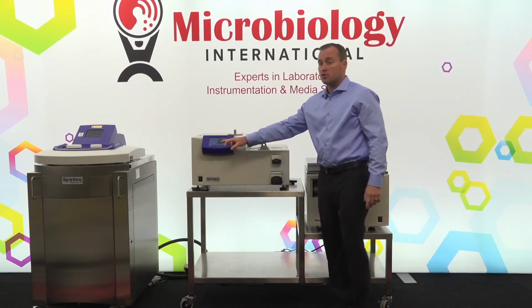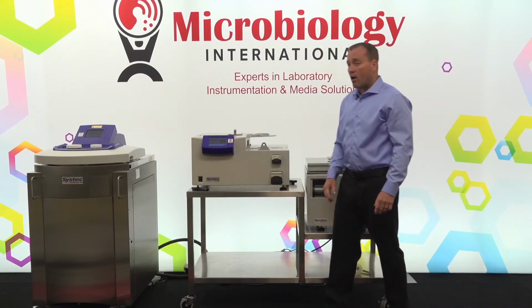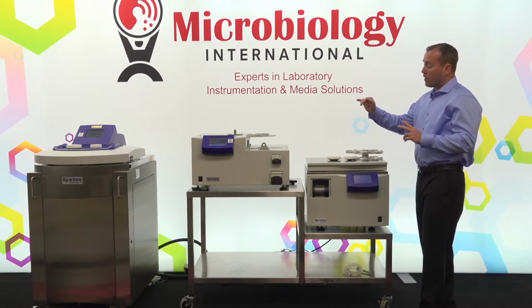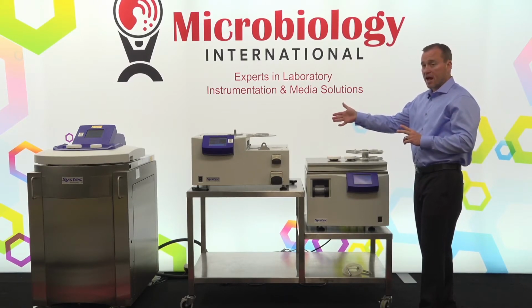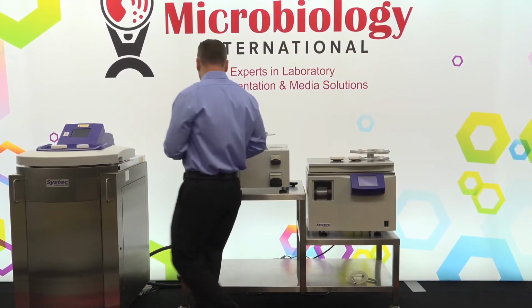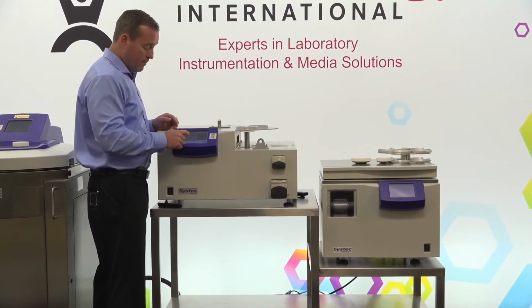So the cleaning is directly on the main screen. If I go into the cleaning area, now I can rotate and move any of the axes in here. So if I wanted to lift the feeder or the stacker piston and clean out from underneath that, I can do that just from the screen. So you can see these moving up.